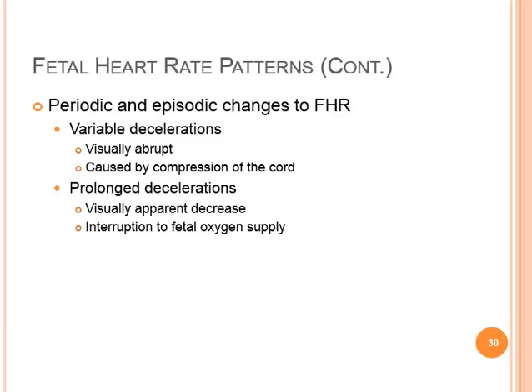A prolonged deceleration is a visually apparent decrease in fetal heart rate of at least 15 beats per minute below the baseline and lasting more than 2 minutes but less than 10 minutes. A deceleration lasting more than 10 minutes is considered a baseline change. Prolonged decelerations are caused when the mechanisms responsible for late or variable decelerations last for an extended period.